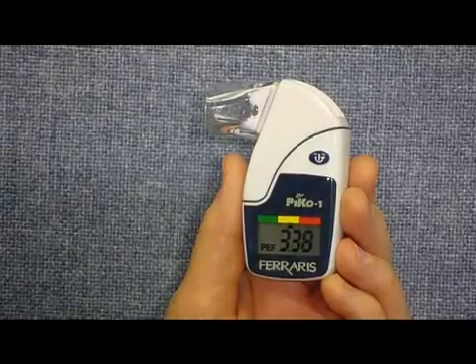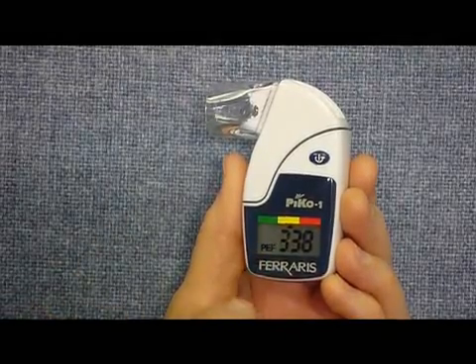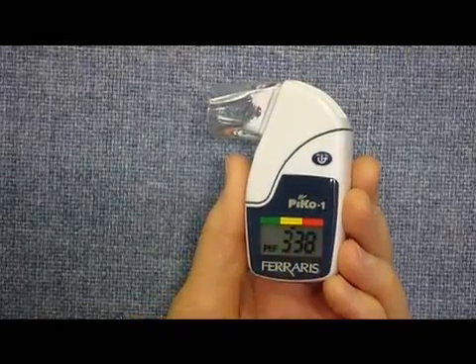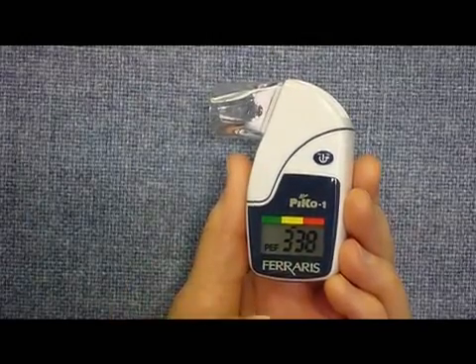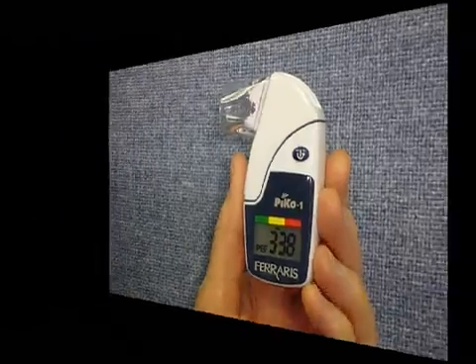When it comes to recording your results, after each test you're going to record the FEV1 — not the peak flow, but the FEV1. It's the one with the decimal point in it. So in this case I'm going to record 2.26 as my FEV1 for that maneuver. And I'm going to do five maneuvers and record them all.